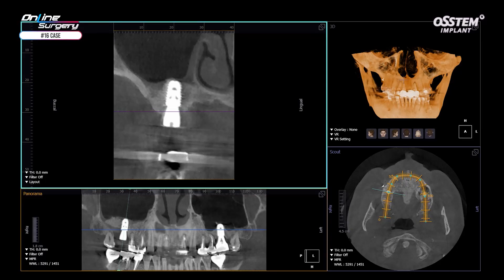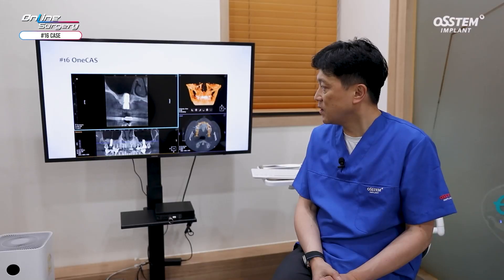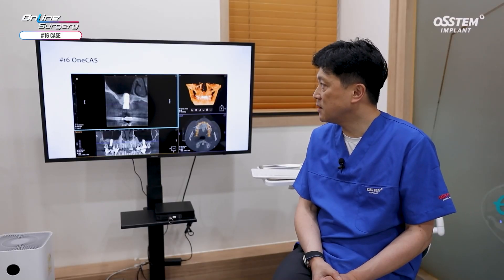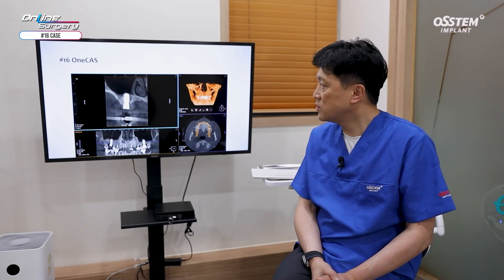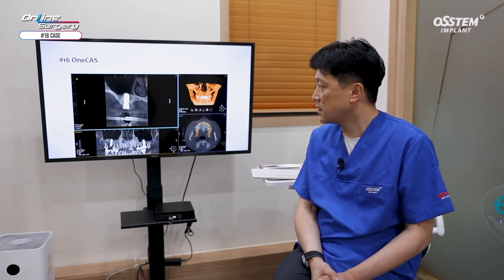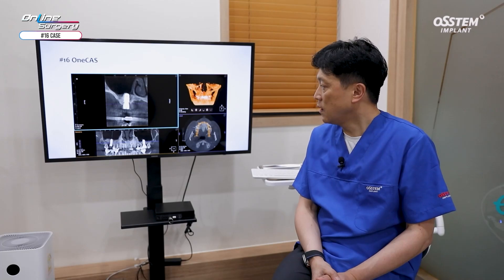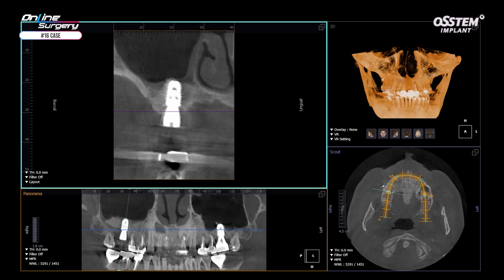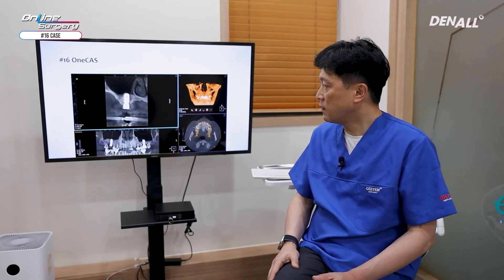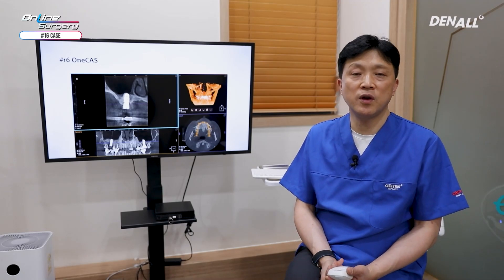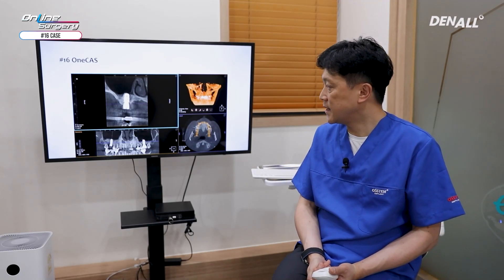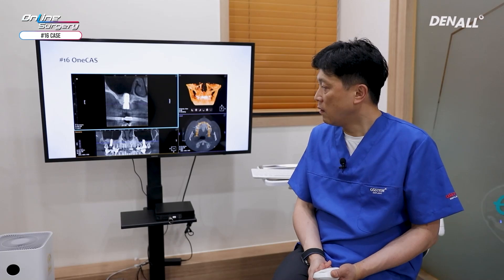On CT, in a certain sense the level of bone regeneration was quite insufficient; however, the implant was placed in an ideal position. As you can see, the amount of bone contact on the mesial side and distal side differ significantly. For this patient, the plan is to deliver the final prosthesis after four months from surgery so as to allow sufficient healing.